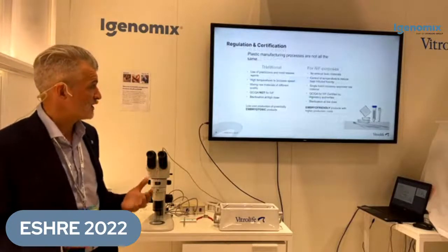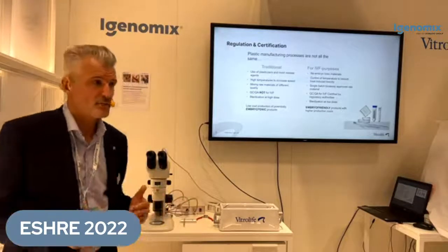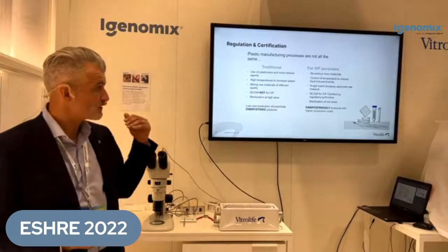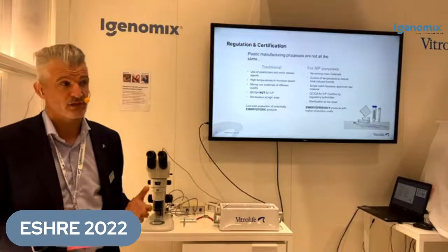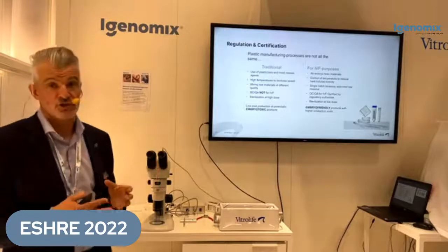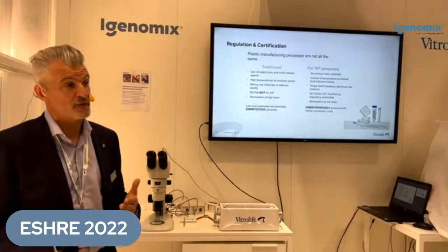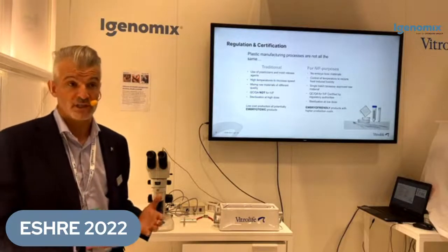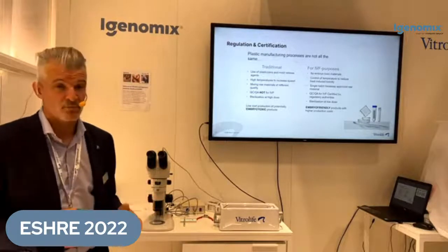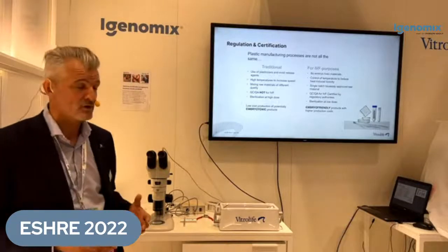So if we look at this in a little bit more detail, the manufacturing processes for these devices are very, very different. Where you have a device that has been certified for IVF, this will have used non-embryo toxic materials in its manufacture. It will have a strict control of temperature to reduce any heat-induced toxicity in its manufacture. There'll be a single batch bioassay used for all of the raw materials that are used in the manufacture of that plastic, and it will be certified by the appropriate regulatory authorities. And this results in an embryo-friendly product.